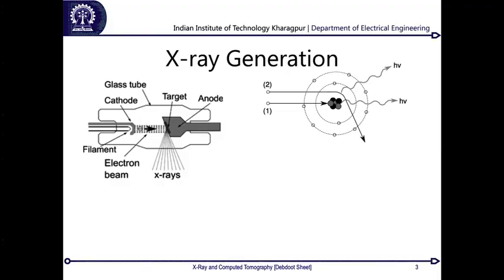But the other difference is that, unlike say lasers, they are not a very concentrated beam, but a very divergent beam which is coming out over there, which actually has an advantage in our case, because now we can create magnifications very easily. Since it is emitted from one single point, it behaves as if a point source of light emitting isotropically in all directions. So, you put an object over there, and you get a magnified view on a film which is placed behind it.